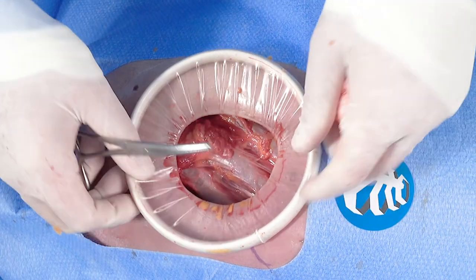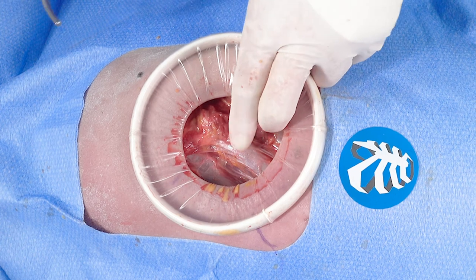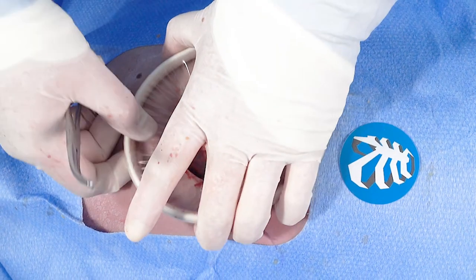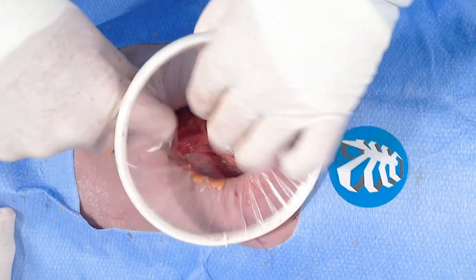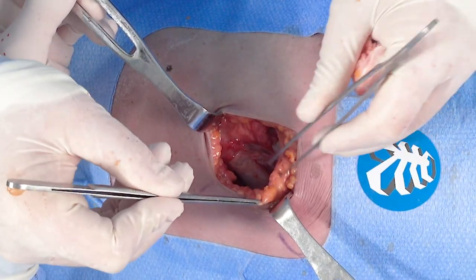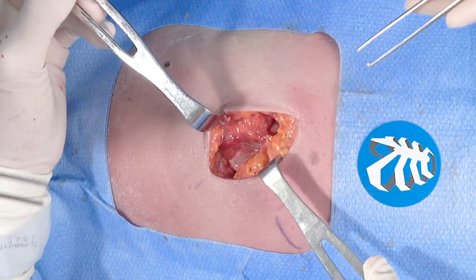Dr. Christie, that's a fantastic exposure. Once you've put your fixation devices on and you're ready to close, can you take us through the layered closure? Absolutely. Because you didn't cut the muscles — you split them — you do want to re-approximate them. Generally, once everything's been restored, we want to create muscular coverage and restore anatomical positioning of the muscles.